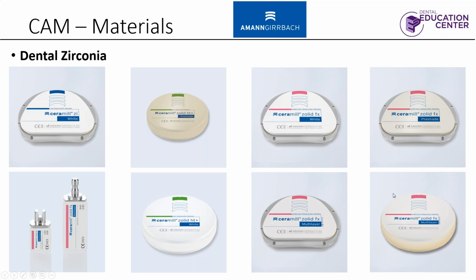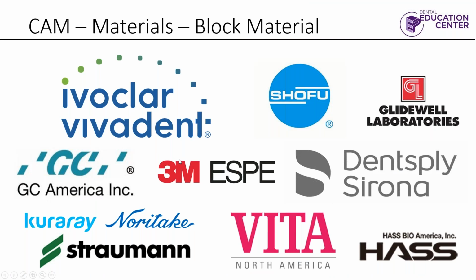Then there's the FX multi-layer, where you do an A1, A2, A3, A3.5, A4, whatever it is, and it comes out of the sintering oven with that gradient, which is really nice. It also comes in a block material. There's a new material that is a cousin of the HT Plus. It's called Gen X, which is actually that 1,100 megapascal material which has a gradient in it.